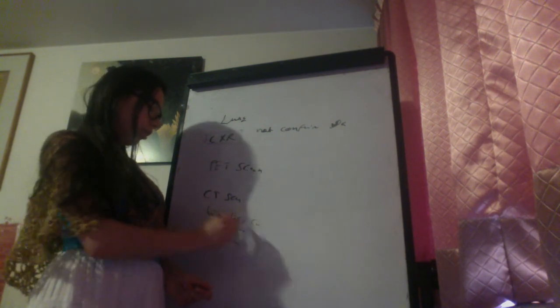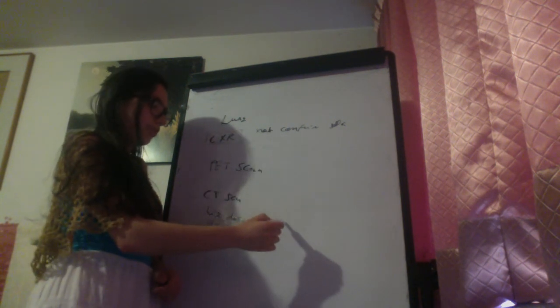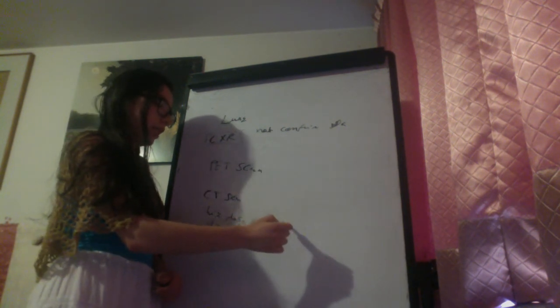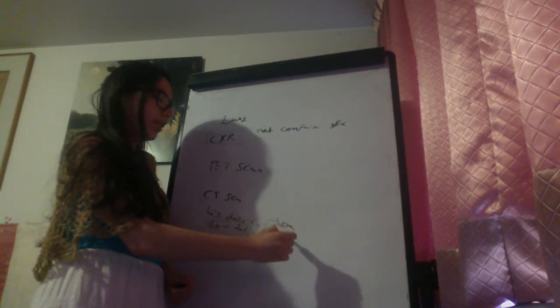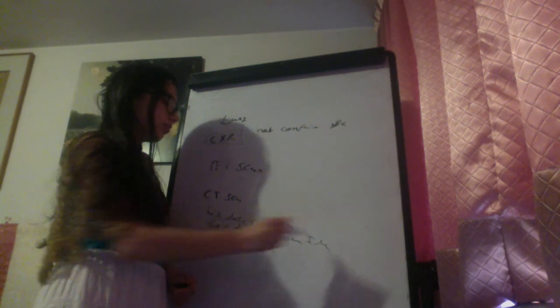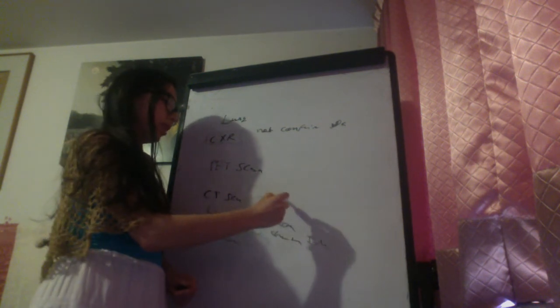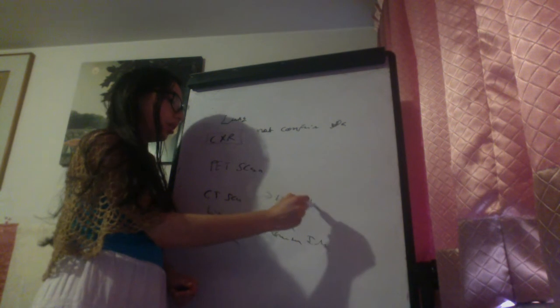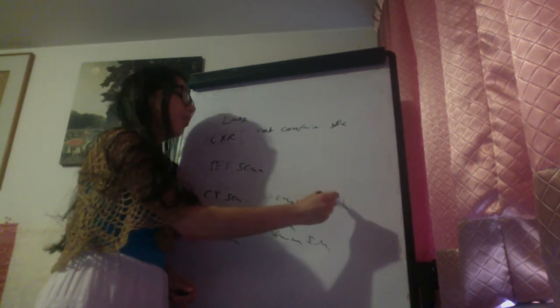The low dose is usually used for other diseases like some screening, or for visualizing honeycomb lesions for interstitial lung disease. The CT scan assesses the mediastinum, pleura, and interstitium of the lung.